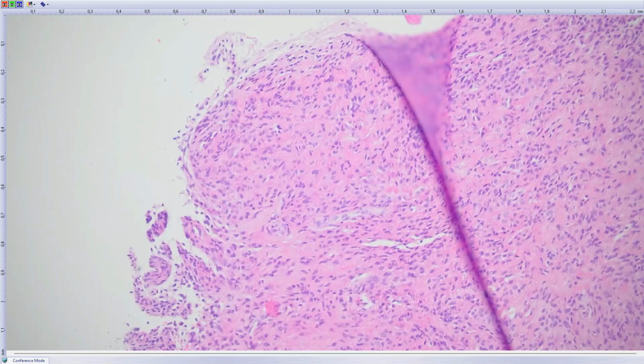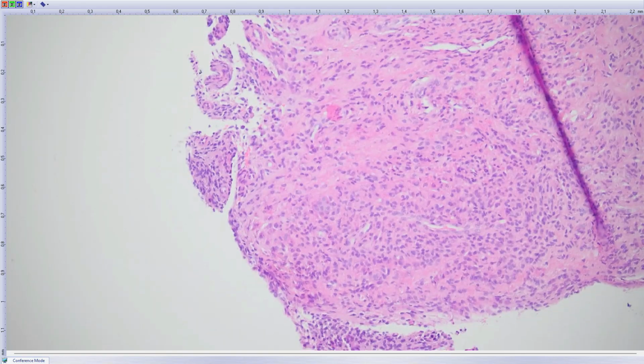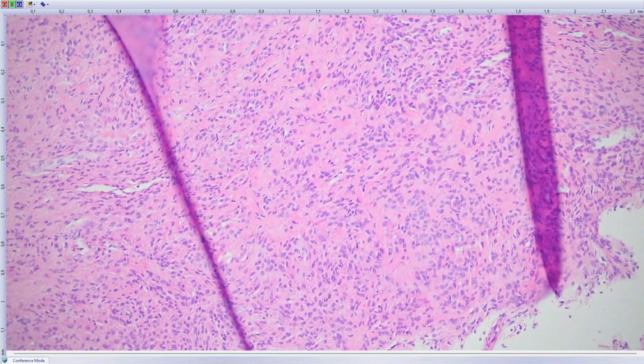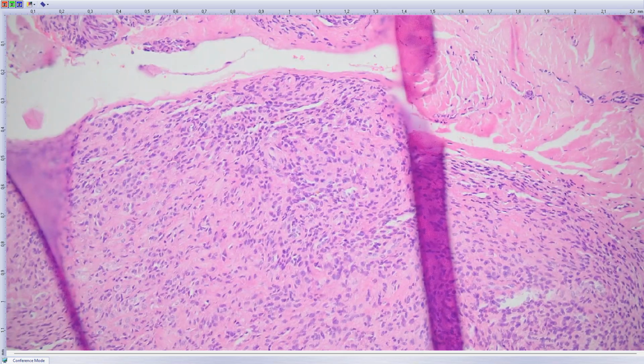You see here some kind of round ovoid cells, but also you see giant cells, perhaps. You can see it here in the center. The H&E is not perfect, but that's what we have. And then, besides the giant cells, there is some sclerotic stroma in between, and some kind of histiocytoid-looking cells. And because we are on the finger of an adult person, we have giant cells in sclerotic stroma.